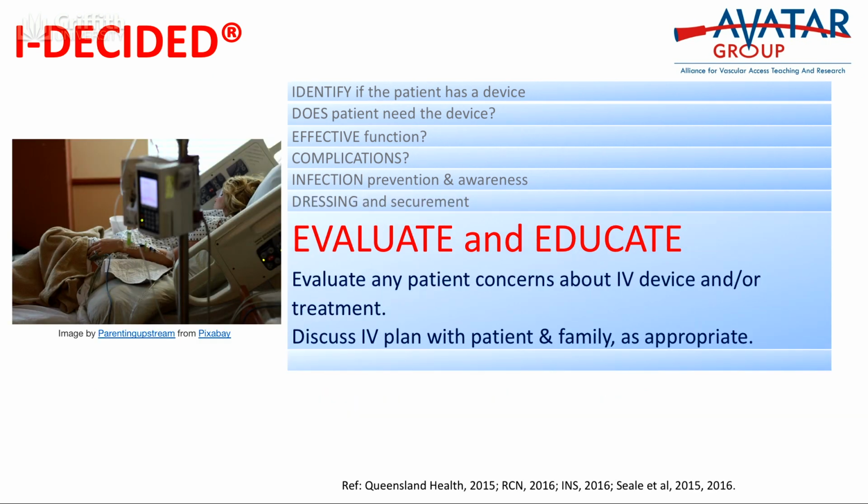Now, too often we forget to involve the patient in the IV assessment. So the I-Decider tool makes this a priority. We need to evaluate if the patient has any concerns about the IV device and their treatment. And if they have questions, we need to educate the patient about the IV plan, when the IV will likely be removed, what to look for complications.